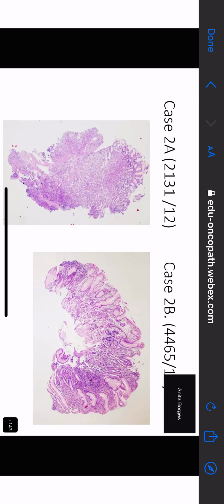Dia? No, ma'am. In body type of mucosa, there will be mainly parietal type of cells and also chief cells. Excuse me, ma'am, we are talking about the foveolar epithelium. What is the length of the foveolar epithelium with respect to the glands in the body mucosa? Ma'am, it will be shorter. How much shorter? 25 to 75 ratio.